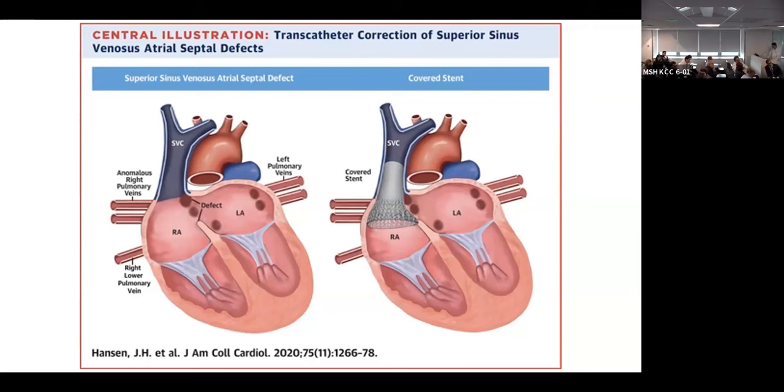If the device is there, it may move, that's bad, or it may perforate the heart, that's also bad. If those things don't happen, the device will stay there and will do a good job. From my mind, that is a very simple way to approach this. And of course, you need some safety feasibility data about the basic things, but we know what technology does not perforate vessels from everything we already know from this field.